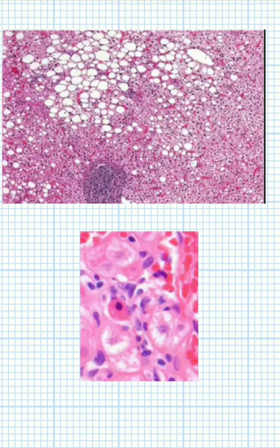Hi everyone, so we are dealing with liver pathology. In liver, you can see two important bodies, Councilman bodies and Mallory Denk bodies. In this picture, it is depicting Councilman bodies. Here you can see a highly eosinophilic structure, isn't it? So what is the peculiarity? At the center, you have a condensed chromatin. So that is Councilman bodies. Its cytoplasm is highly eosinophilic and you have a condensed chromatin. This Councilman body you can see in viral hepatitis.